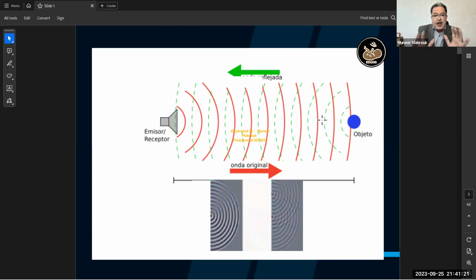Now the exact shape of the sound is exactly like the waves of water when you throw a stone in the water. When you throw a stone in the water, you will see these waves. It's mechanical energy. The lines on and off, on and off.